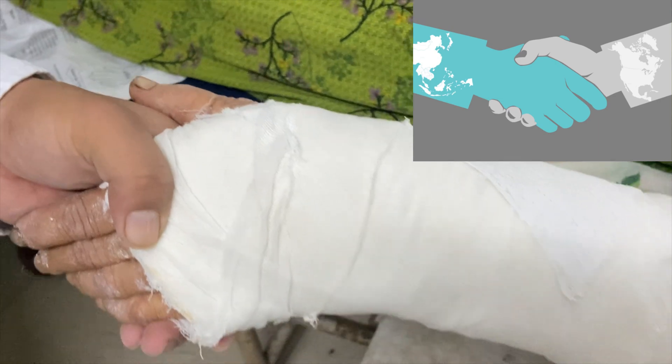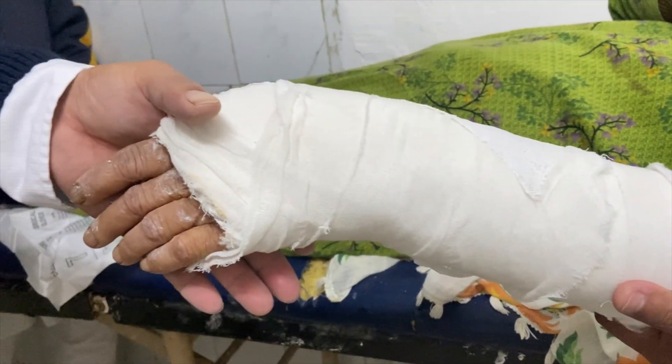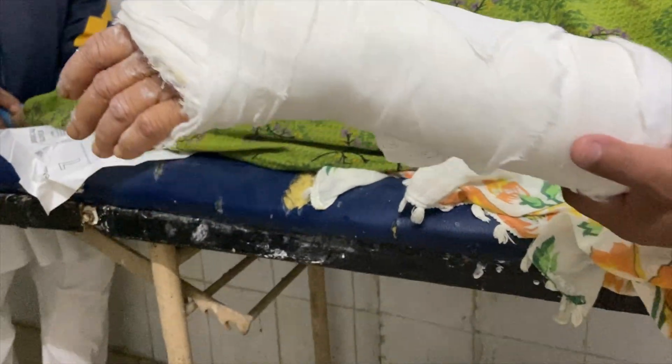Ideally a full cast should be used, but here I am using a backslab because the patient has severe swelling and the skin condition is also not good.